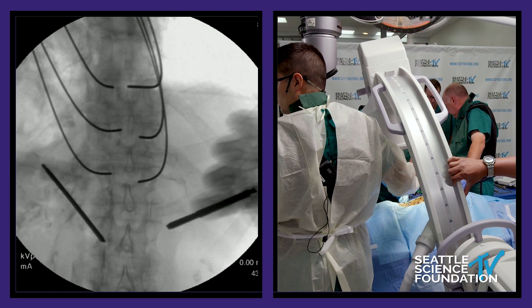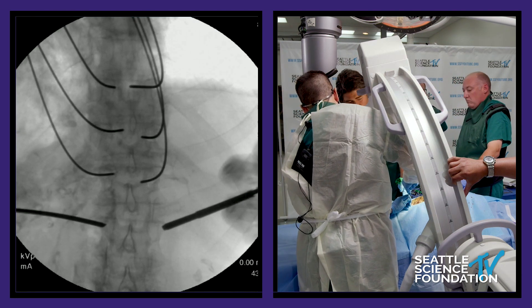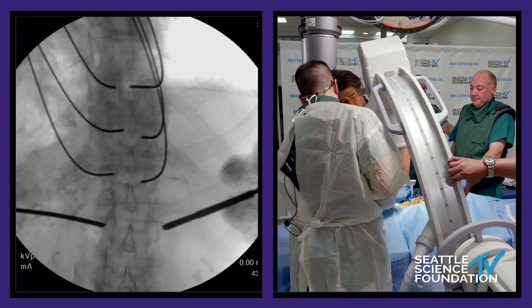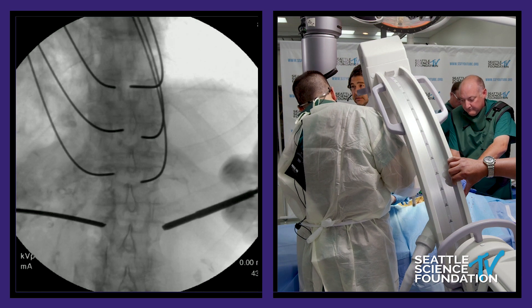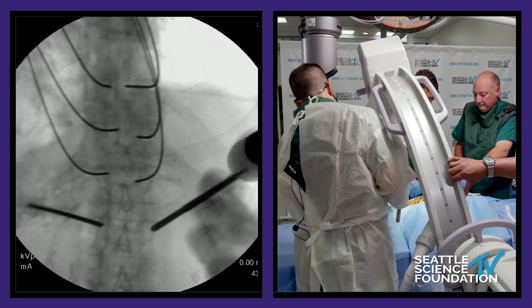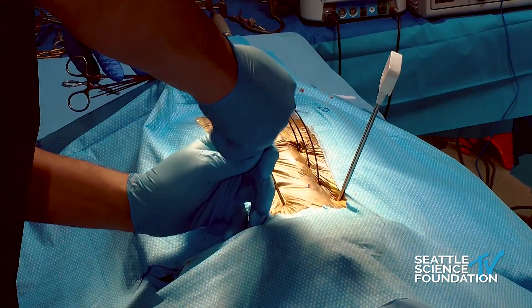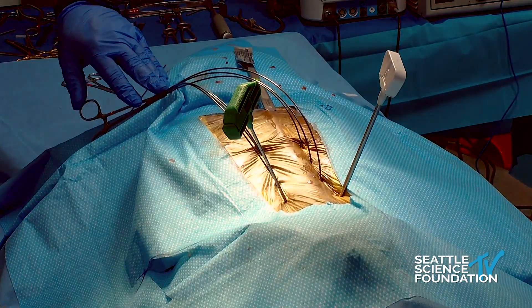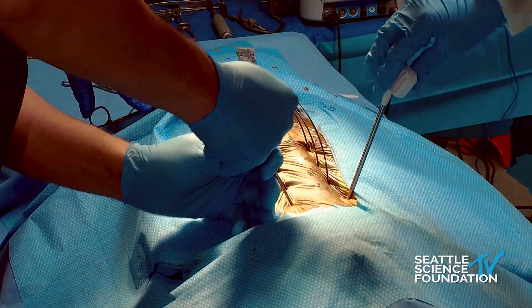When you're doing this you really have to be careful with these guide wires, because when you put them in — you'll see here in a second — we're going to tap and then put our screws in. It's really easy to advance them. For a trauma case, or if you're just doing a case where you need some fixation, learning how to do percutaneous screws in the lab and during your fellowship is really, really critical.